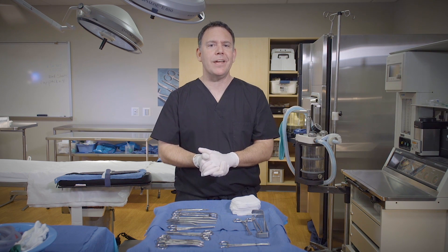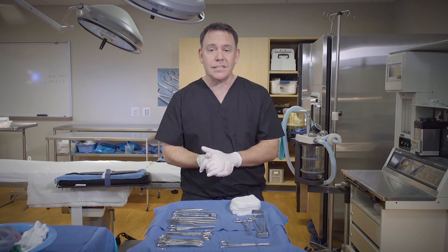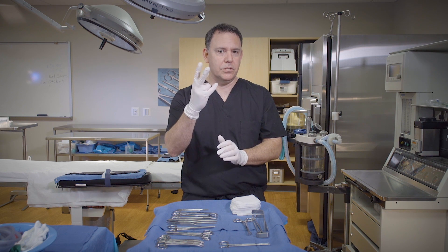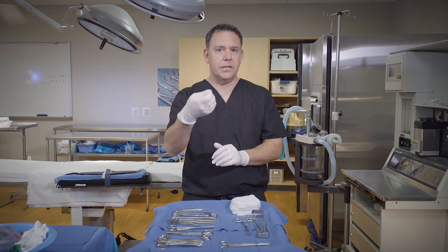Before we get started, I want to spend a second teaching my surgeons everything they need to know when participating in this exercise. As the surgeon, your main job is to verbally ask for instruments and to use hand signals to ask for instruments. Those three main hand signals are scissors, tissue forceps, and stitch.